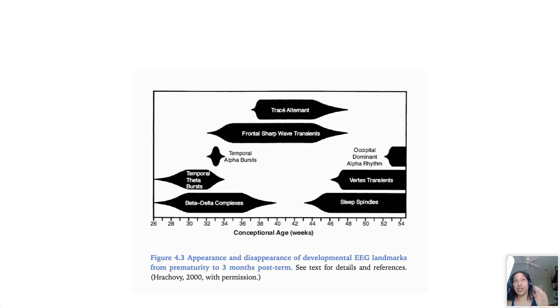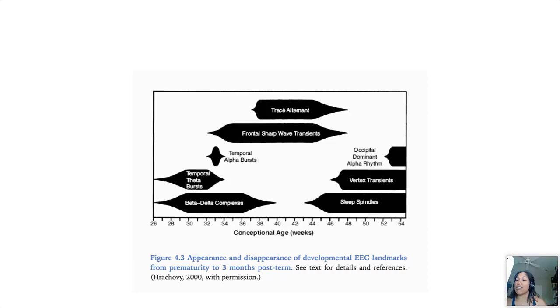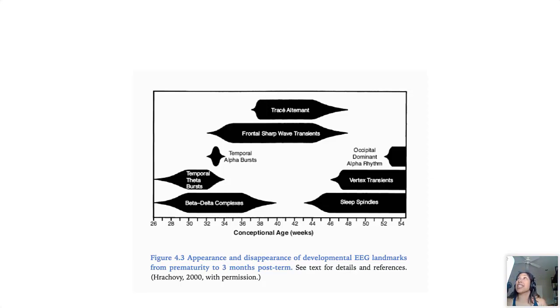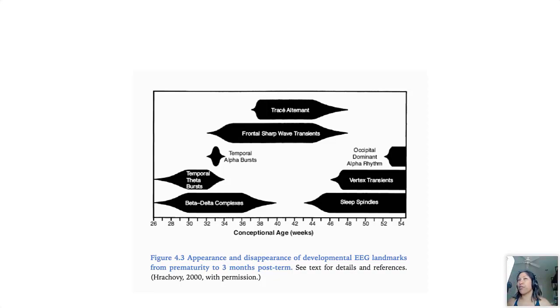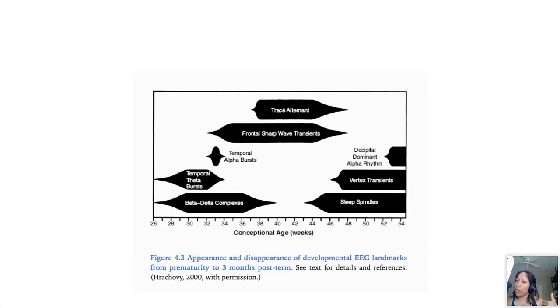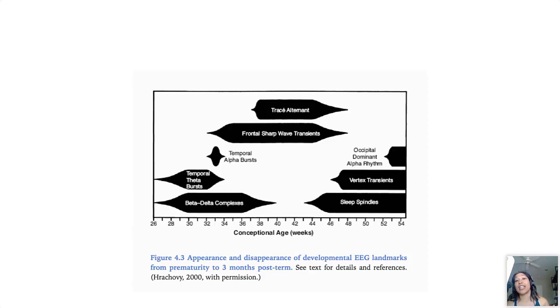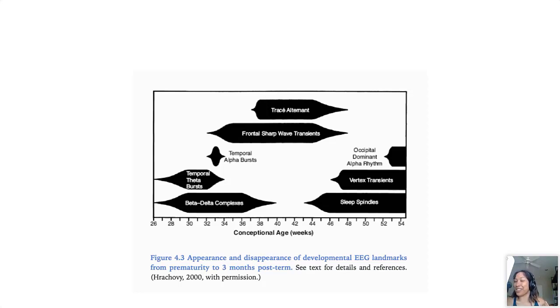So spindles, I usually think of spindles starting at around six weeks to two months. We kind of use a little mnemonic for spindles that you start to see them around two months and then they should be synchronous by around two years. That's kind of the little frame of reference that we use for sleep spindles. So in the beginning in little babies when you see sleep spindles you might see them just in the left hemisphere or randomly in the right hemisphere and not lining up at all, and that is okay until all the way up until two years.